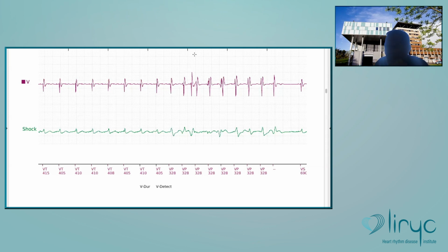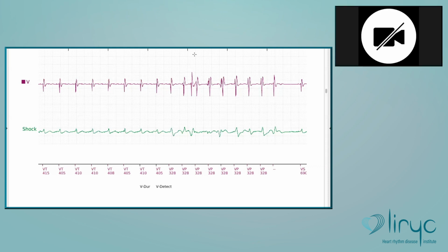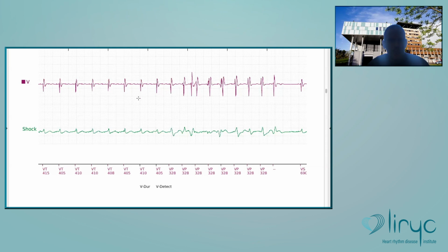So it's not so infrequent that for any kind of arrhythmia, SVT, if you receive one therapy, you may receive all the therapies. So if the arrhythmia is prolonged, for example, atrial fibrillation or sinus tachycardia, you may receive, like in this patient, 8 consecutive shocks. Okay?